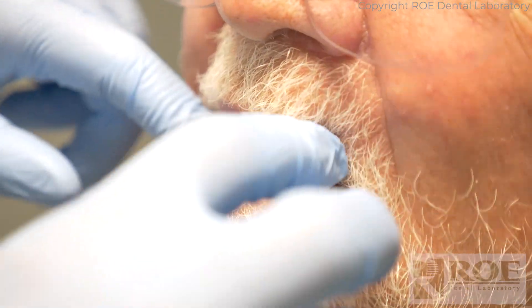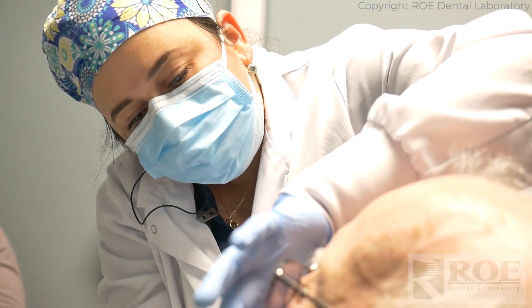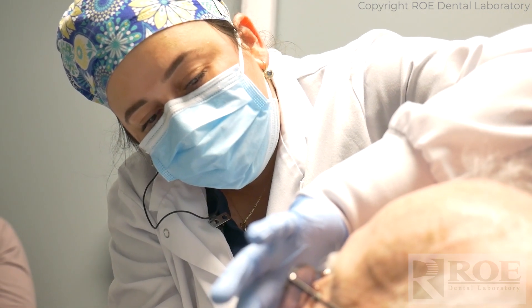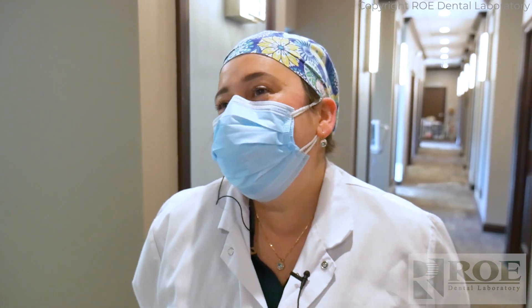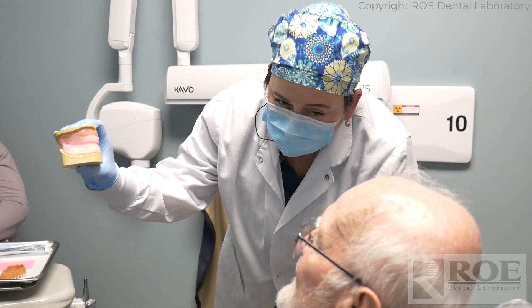Hopefully we won't have to make any adjustments and can give Elmer his dentures right away. I'm also curious about how long we can keep records on file and still make it work. It's a great idea because so many times we've had patients say, 'My dog got a hold of my partial, my dog got a hold of my denture,' and we'd have to start from scratch. That takes forever — so this will be great.